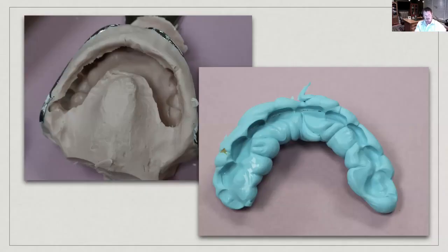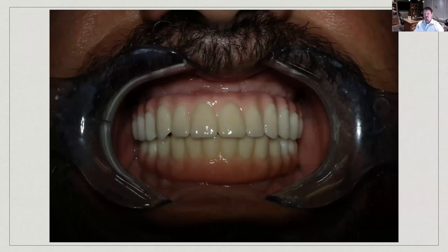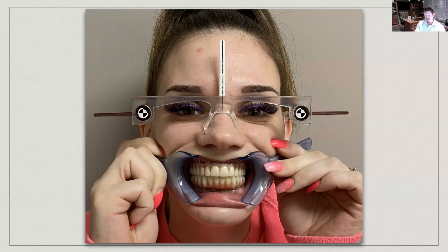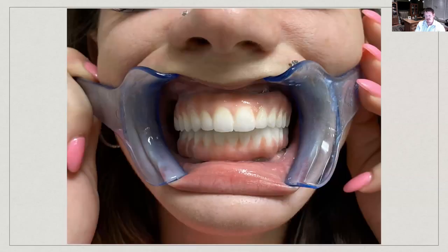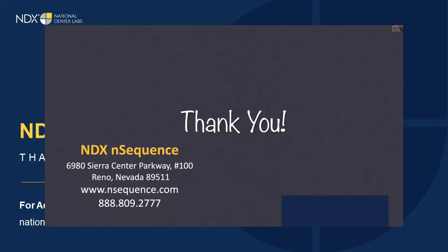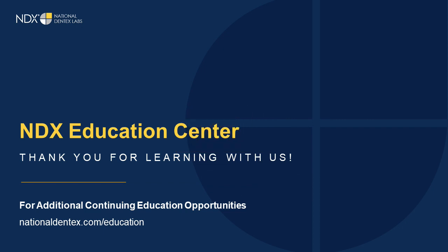Here are the impressions and the final result: a full zirconia upper and lower with a beautiful smile. A pro tip: tell patients not to bite down hard on wax during try-in, as they can break everything. And that's it — thank you very much.